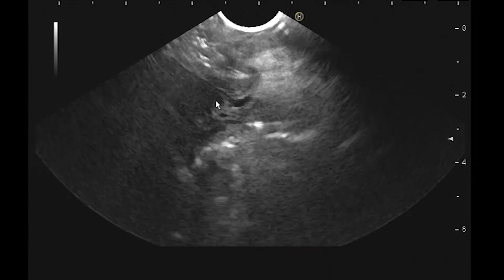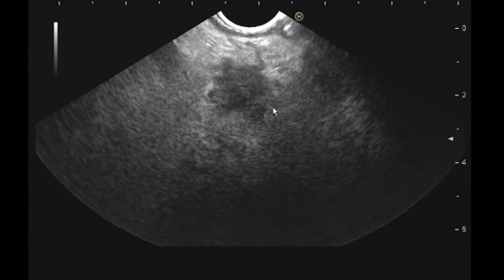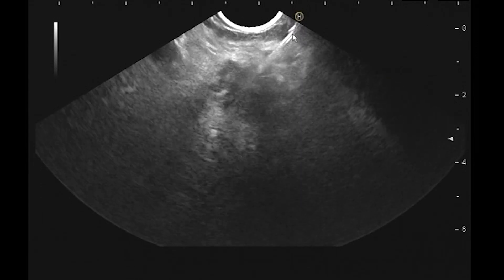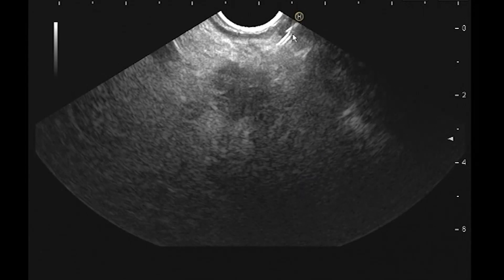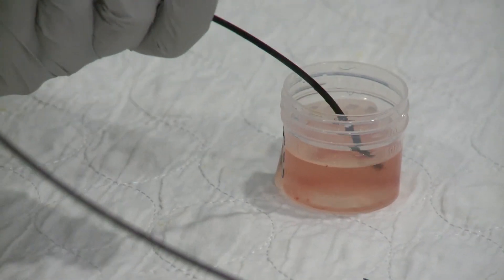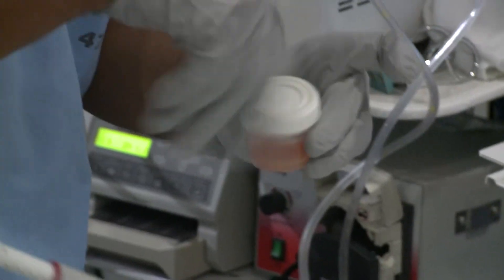There's the lesion again. I want to go really where the lesion starts — where there's no dilated ducts, because that's where the mass is. Torquing a little bit to get it into view. You can see the needle up here, so we're in good direction. I'm going to push the needle in. In we go. We come out, go somewhere else, come out, go somewhere else. Here's our sample coming out — it looks like there's quite a lot of tissue there, and a little less blood this time. I think this is definitely an adequate sample.